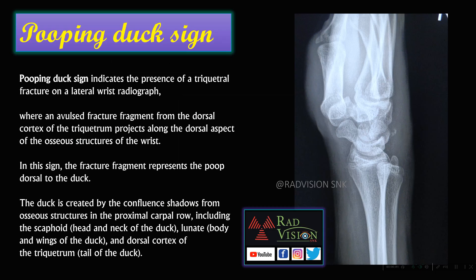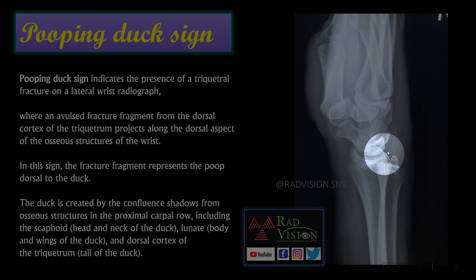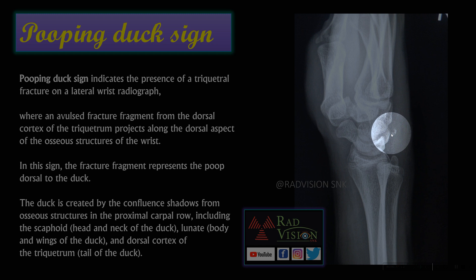This is a lateral wrist radiograph. Whenever you see a lateral wrist radiograph and suspect triquetral fracture, what are the signs we have to look for? Here you can see a fracture noted in the triquetrum with displacement of the fracture fragments dorsally. These fracture fragments displaced dorsally mimic the poop of the duck.